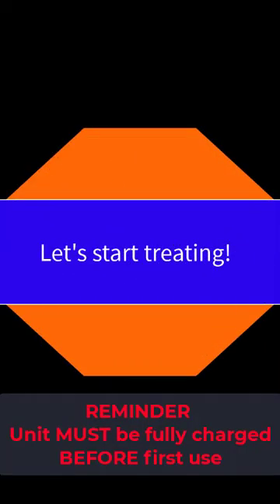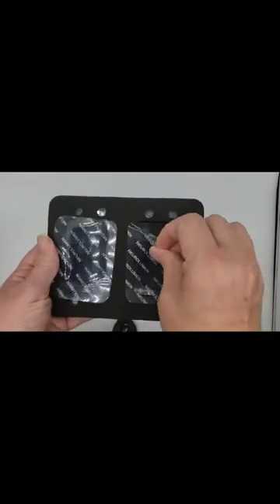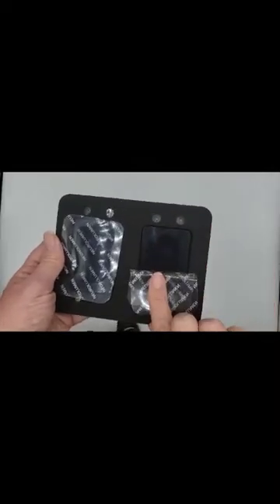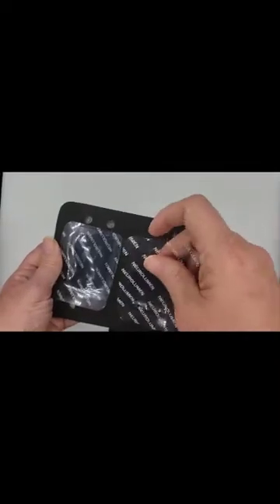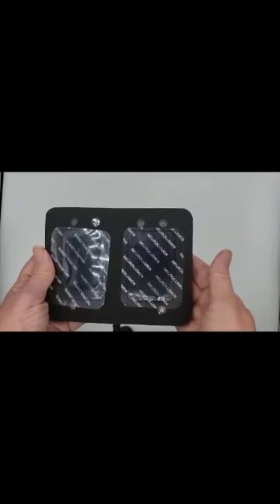All right, let's start treating. In order to use the electrical stimulation, you will need to remove the clear covers. You will notice your gel pads are sticky to help connect to your skin. Once you are done treating, it is important to replace the clear covers to help the lifetime of your gel pads.